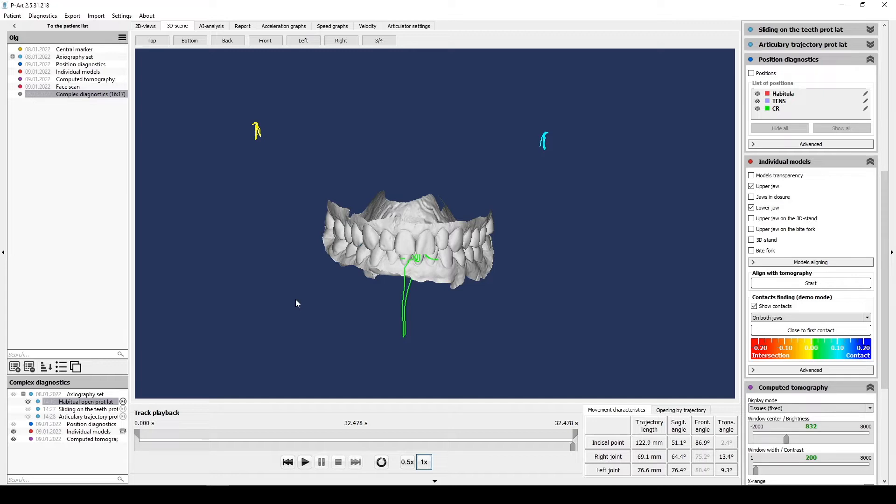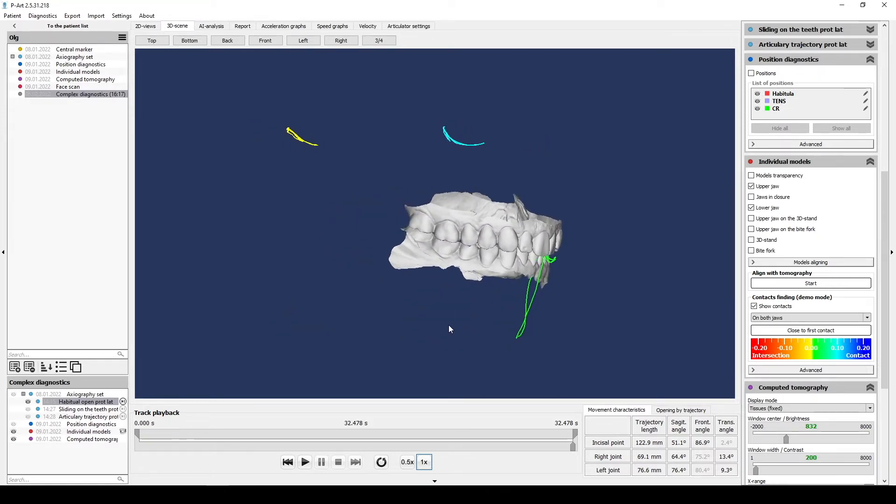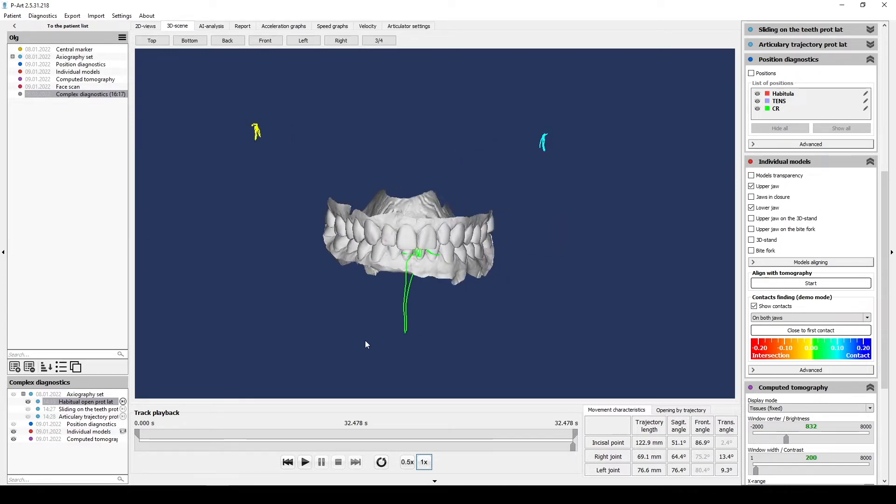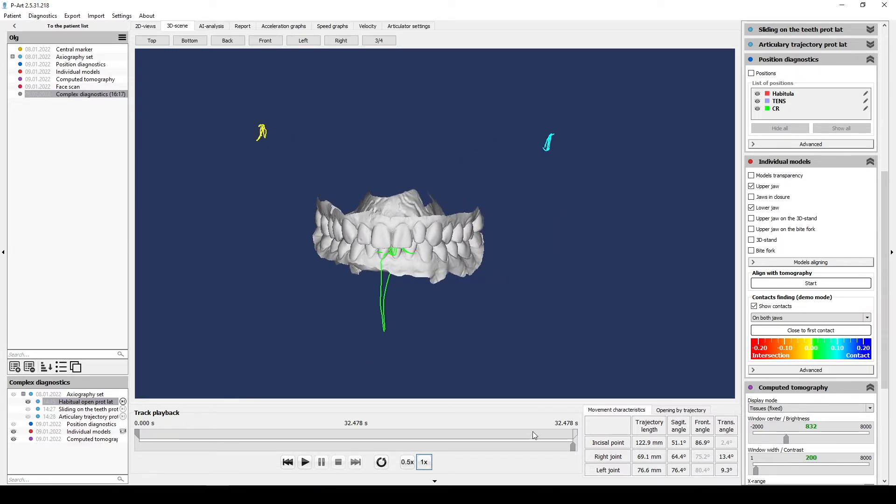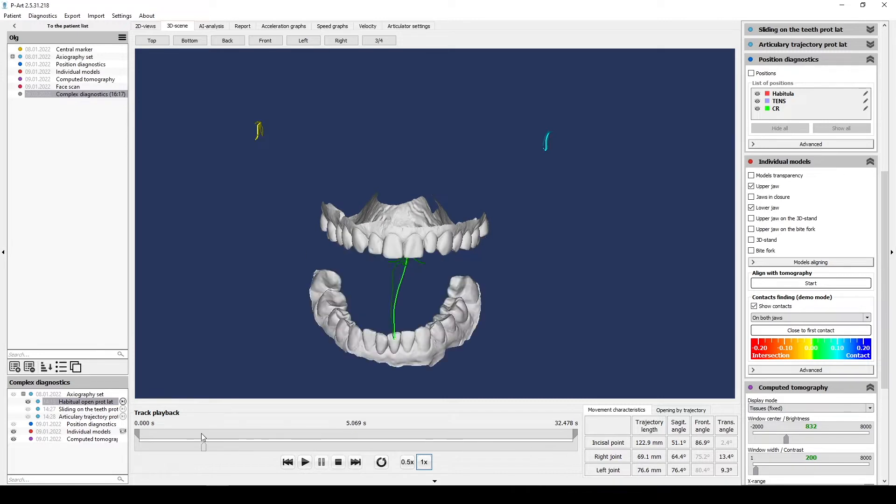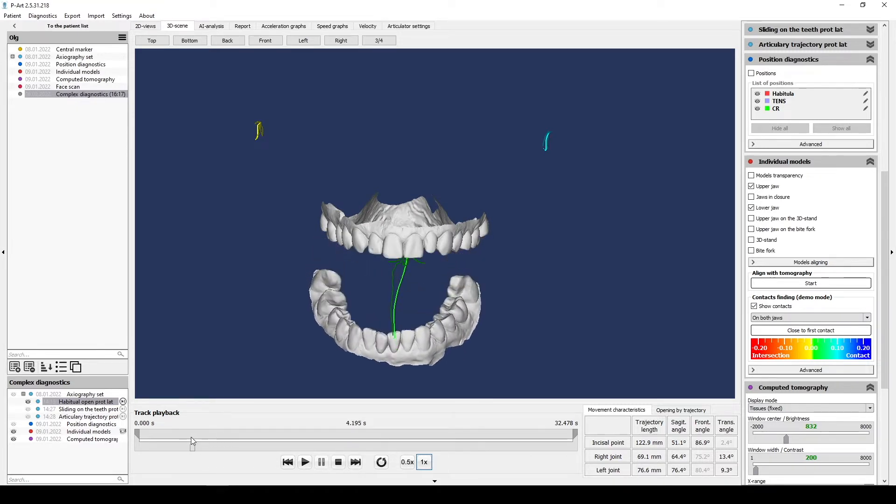We call it habitual movements or stereotype movements. What does it mean? We do this type of axiography. Firstly, we do not give patient any advice and do not rehearse how to move. It must be comfortable to patient. Automatically you understand how these movements are complicated.